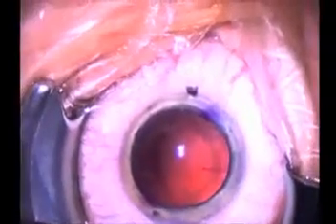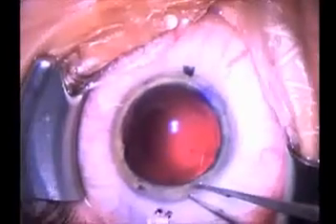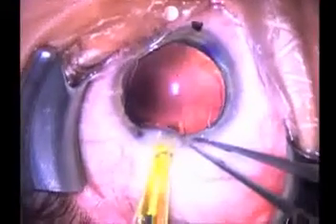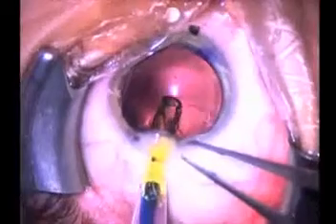You will notice two marks that have been placed on the cornea, the clear window on the front of the eye. These are reference marks that allow us to rotate the intraocular lens into position to correct the astigmatism.